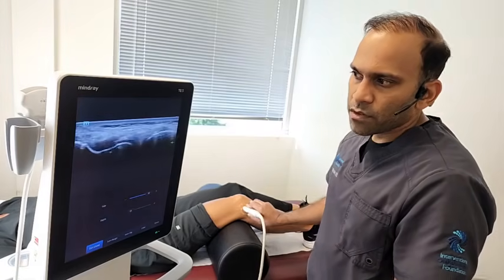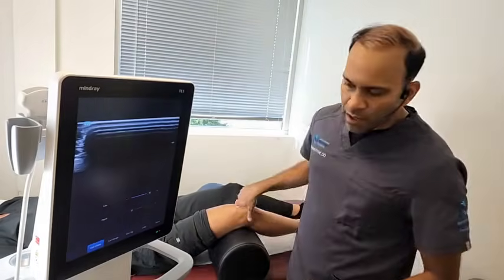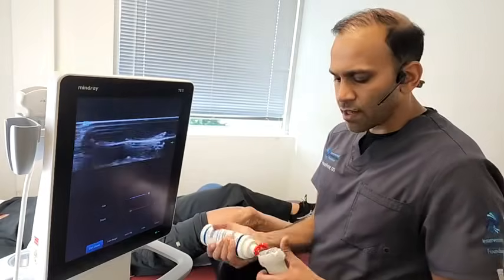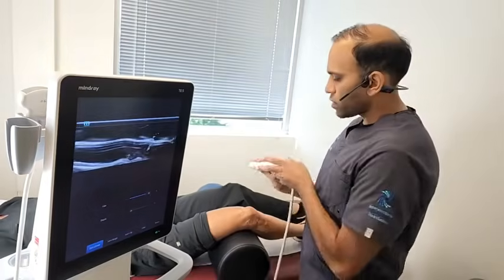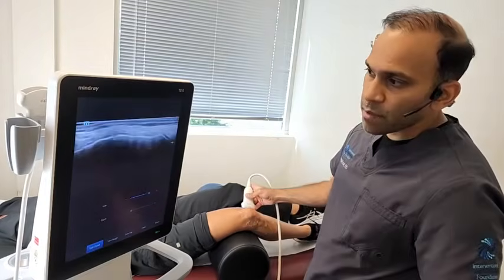Okay. So now we're going to go to the inside of the knee and look at a couple different structures there. Now, two structures that I'm going to look at on the inside of the knee are the MCL, or the medial collateral ligament, and we're going to look at the medial meniscus.